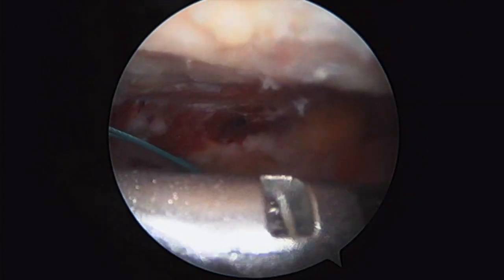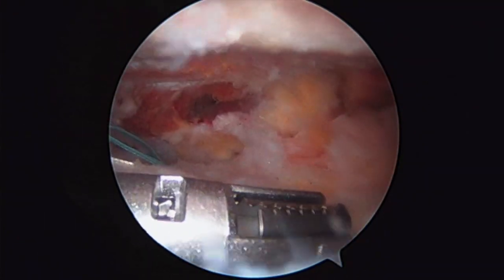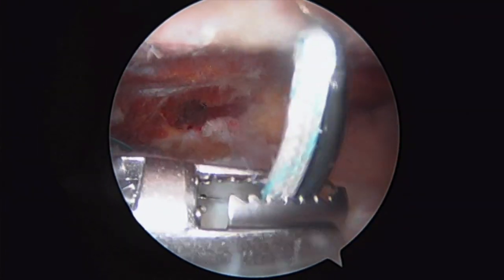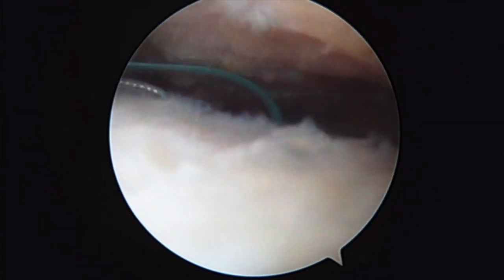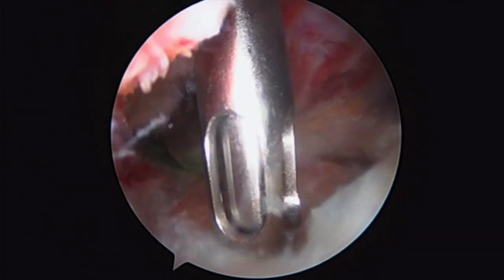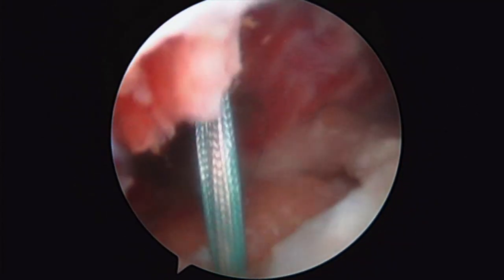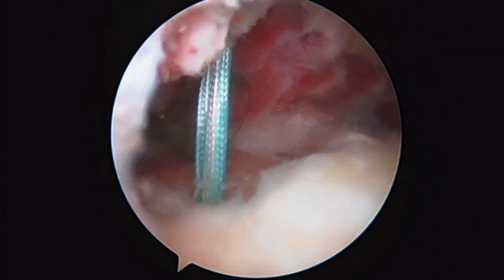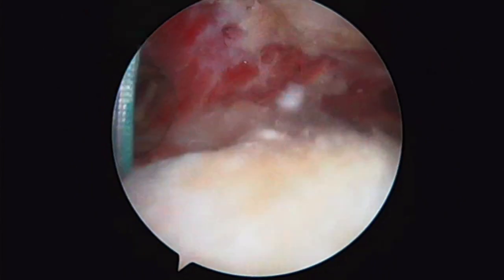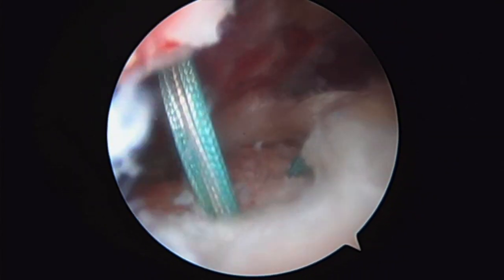Here's our final suture being passed. I've already passed one limb of the white suture, and now I'm coming really far posterior here for a nice bite with the white suture. We decided to use another anchor here, so here's our second medial row anchor. I'm going to pass a couple more sutures here posteriorly in this tear, just to give us a little bit better and stronger fixation.